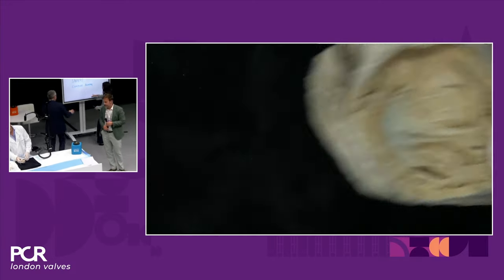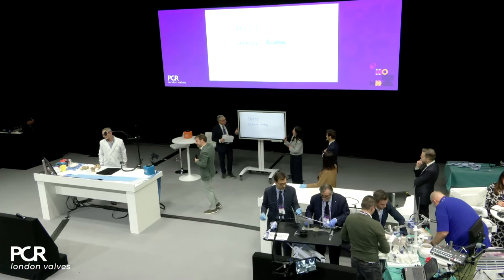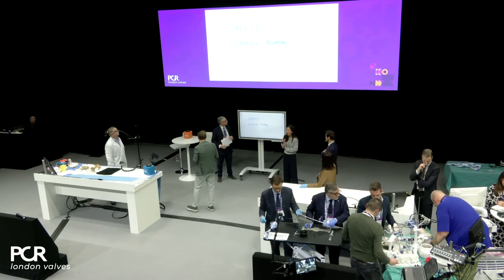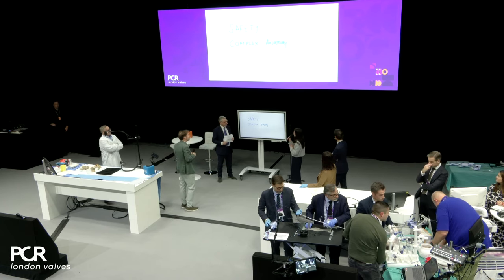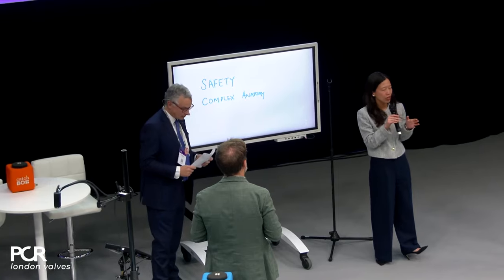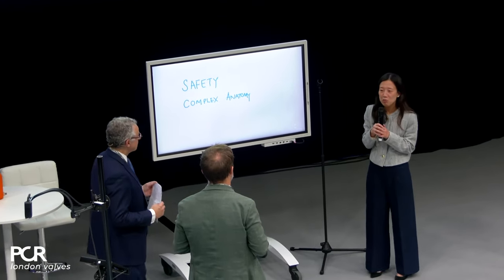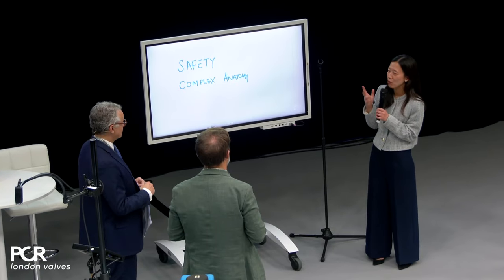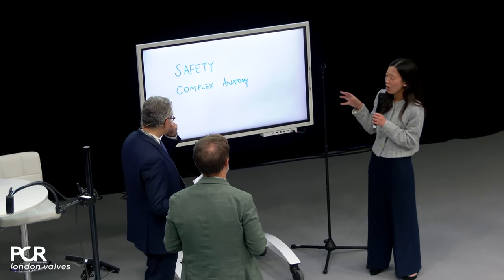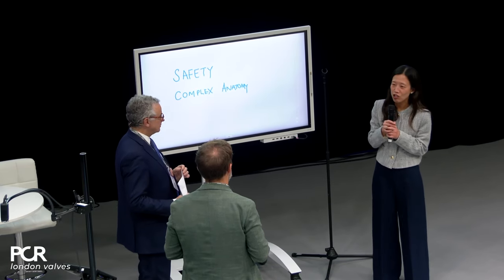You were busy in another room, so what do you get from this case? Yeah, I think the case and what we've seen so far have illustrated the safety of the TriClip system that Anya showed us in terms of the frictional elements. Respecting the anatomy is important, particularly when there's degenerative pathology. And whilst the anatomy is complex, the team have clearly achieved a very effective reduction or obliteration of tricuspid regurgitation in this particular patient. Excellent.